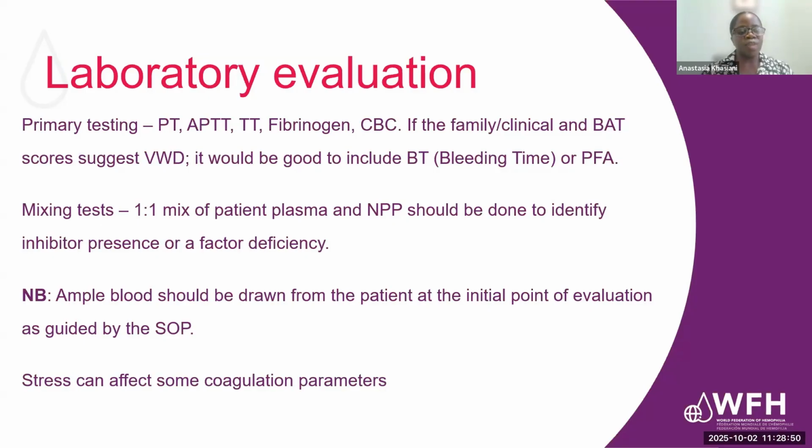Same applies if the abnormality was detected in your initial APTT result. If it is abnormal, then you can do the mix and identify whether there is an antibody or a factor deficiency. And then I need to mention that if it's already mentioned in the clinical notes that the patient is on an anticoagulant, then you do not need to do a mixing test on that result, because for a patient on anticoagulant, you do not need to do a mixing test on it.